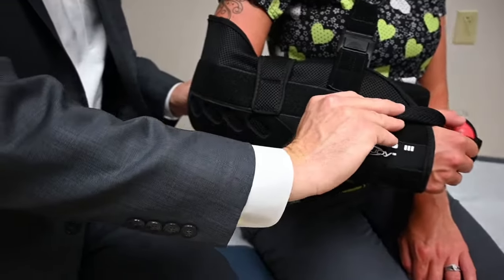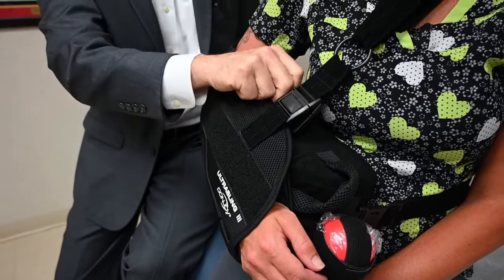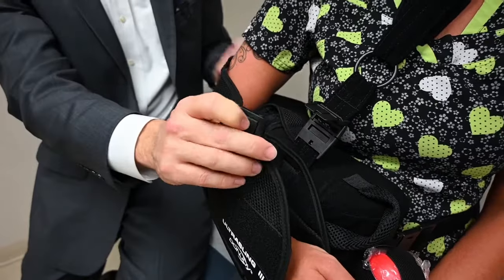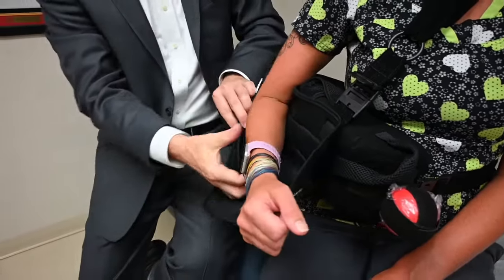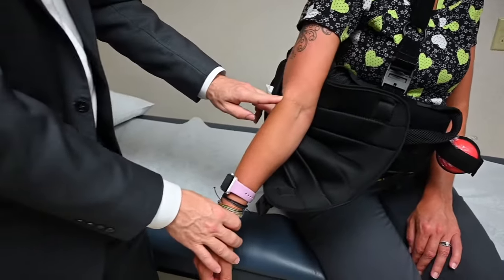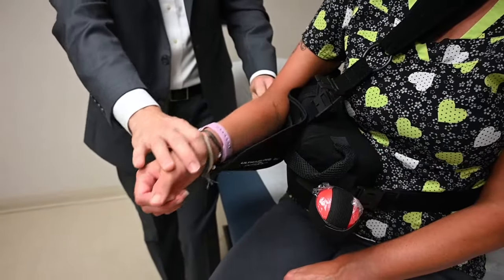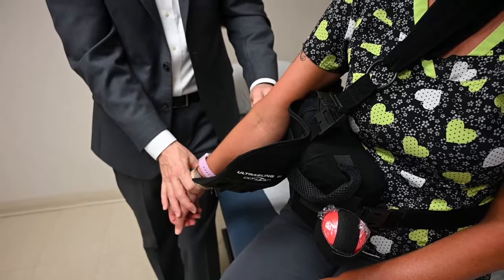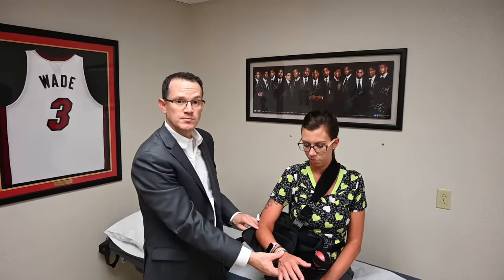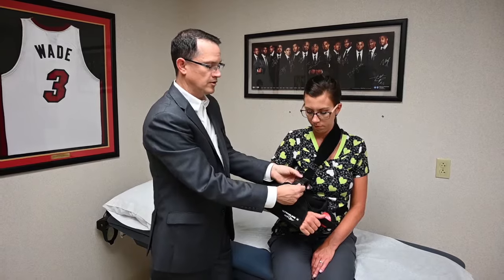It's simply three straps: the strap that goes around the thumb, the strap that comes up over the top, and the front button of the strap that goes around the neck. With those removed, you are completely out of your sling. At this point I want to see the elbow come all the way down straight and all the way back up. Make sure you are not cheating and coming short of full extension, as this could lead to stiffness in the elbow. When done with your range of motion exercises, the elbow goes back into the sling and the clip is reapplied.